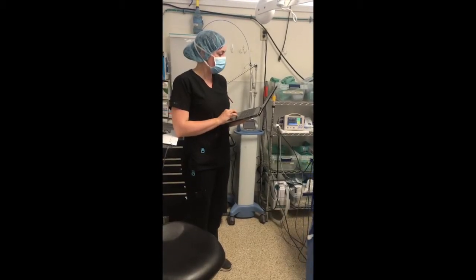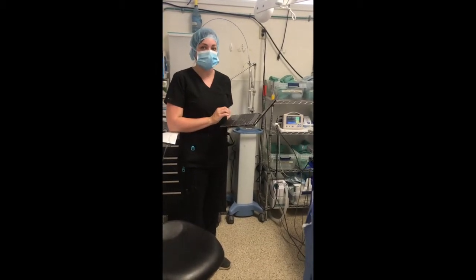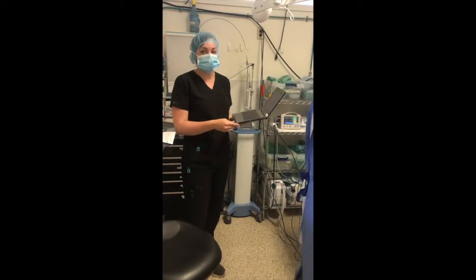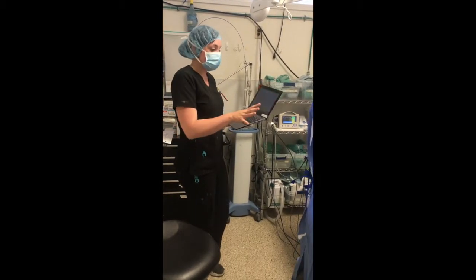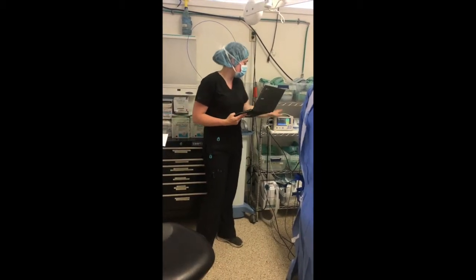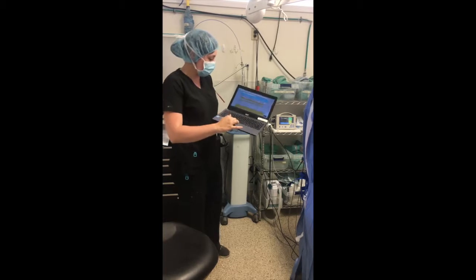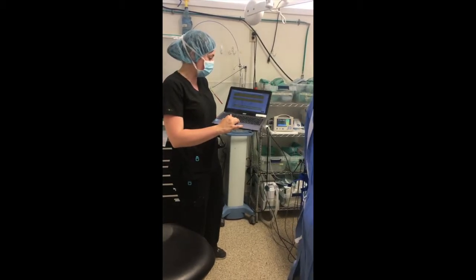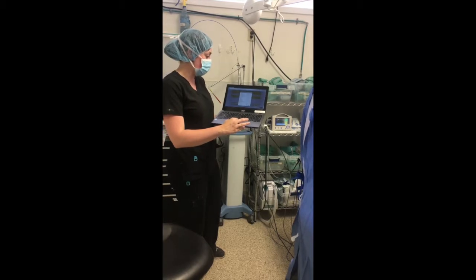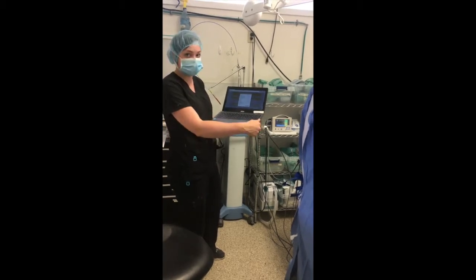All right, this is Dory. I'm going to be demonstrating how to take vital readings for a patient that's in surgery. She's all hooked up and she's having her spay right now. We have our Cardell monitor hooked to her. I have her medical record open here with her anesthetic monitoring form, and I'm going to add a line item for her during surgery time.